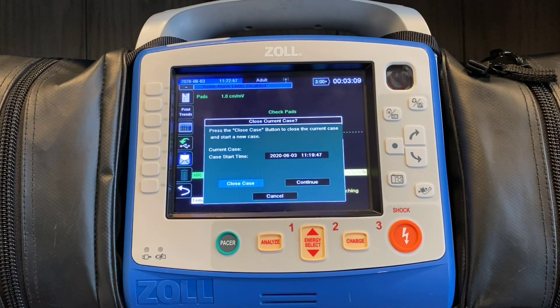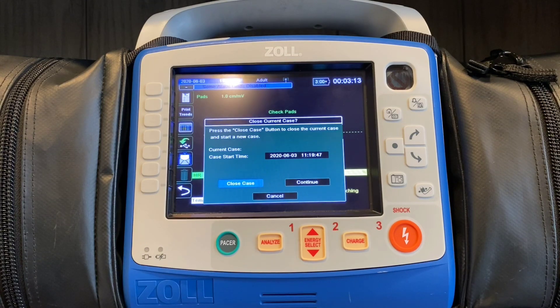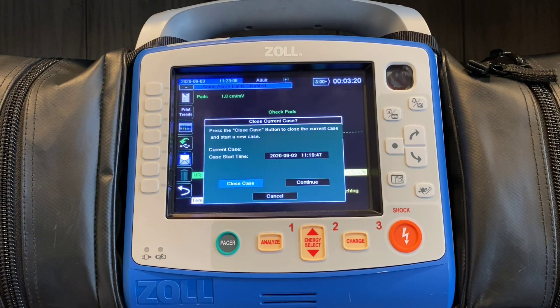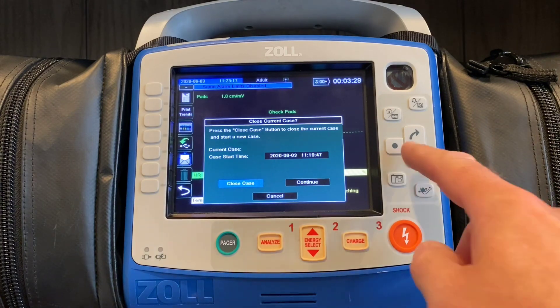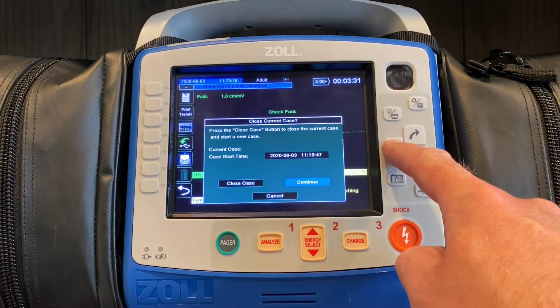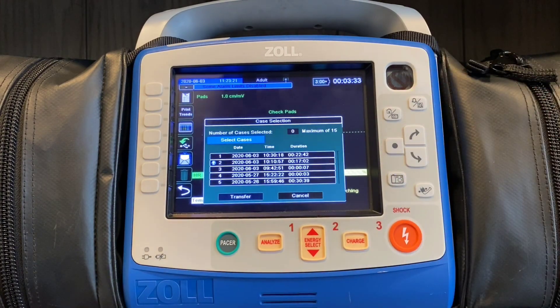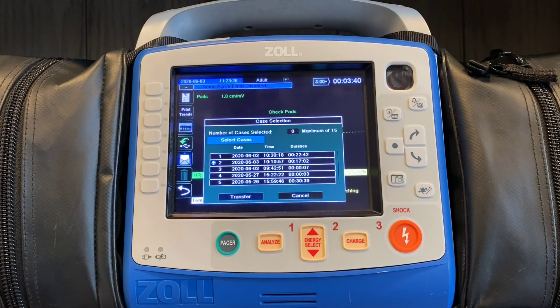When we're moving this data electronically, we want to hit the white envelope. The screen will come up and say, do you want to close case or continue? Depending on when you're doing this will dictate your choice. If it's at the end of the case and you're basically done treating the patient, you can go ahead and hit close case. If this is 10 minutes after the call, you can go in to continue and you'll see a list of the calls that have previously been closed. They're all identified by date, time, and duration, so they're easy to figure out.